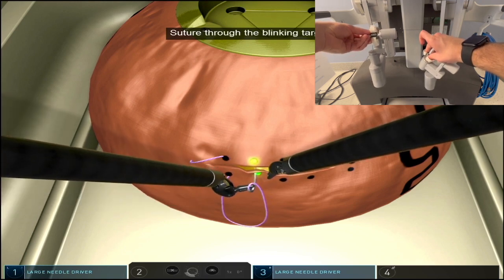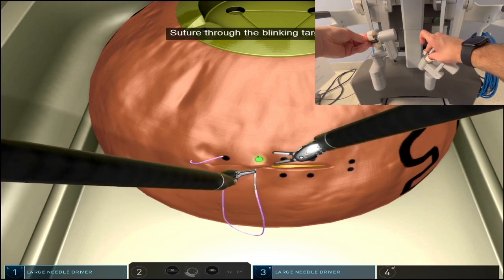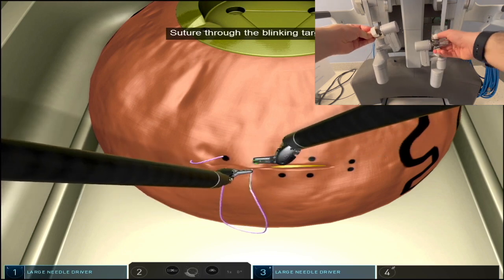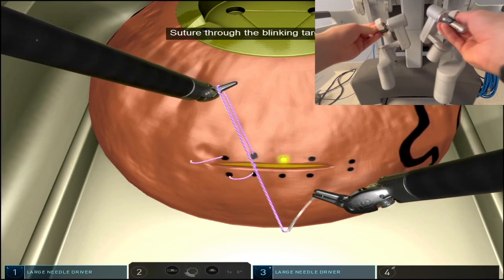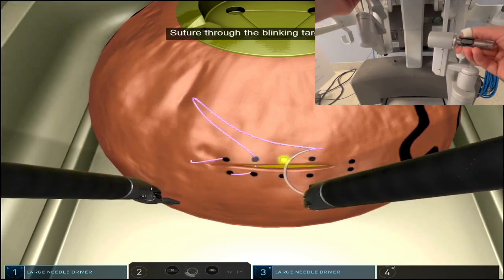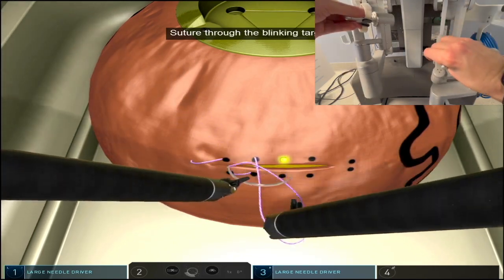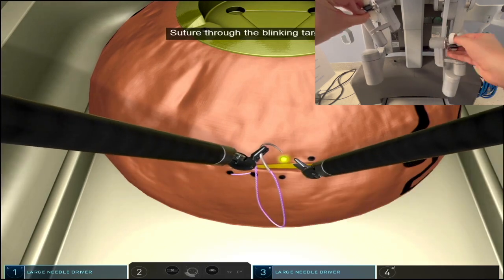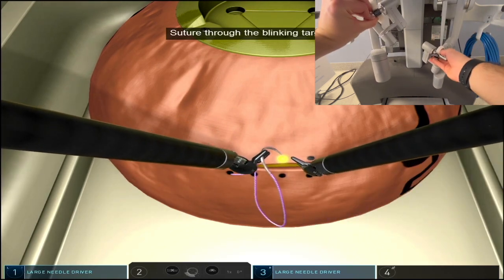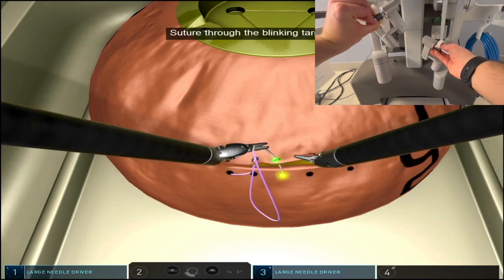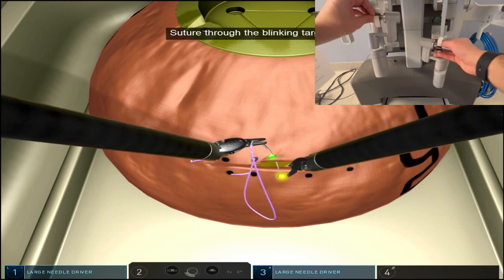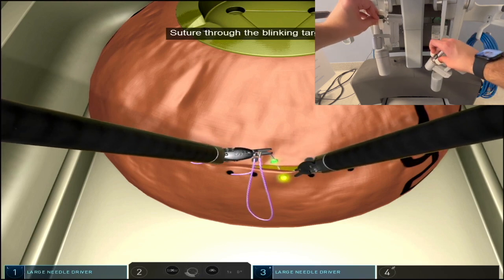You can take these bites either supinating or pronating your hand. For the bites that are directed towards you, from distal to proximal, you can take those bites in forehand.